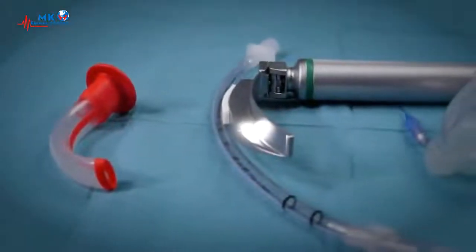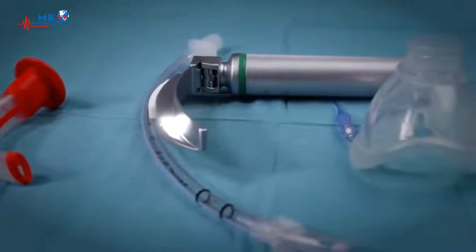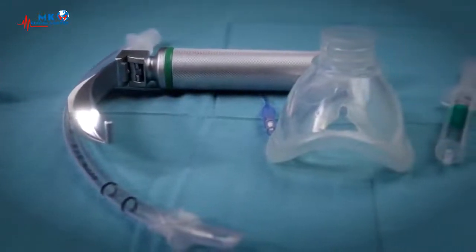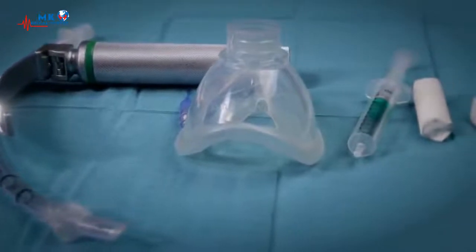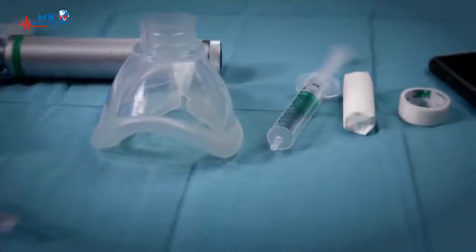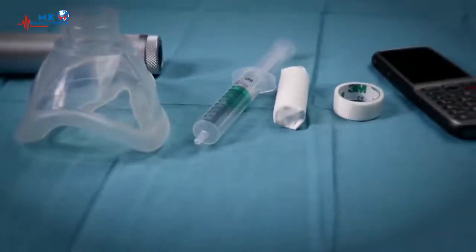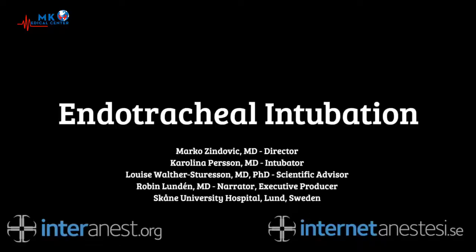Endotracheal intubation is an important part of airway management. It is best learnt through practice under expert supervision, in our opinion first on a mannequin and then on elective, uncomplicated and fasted patients. This lesson aims to prepare you for these practice sessions, and our narrow focus is teaching the manual skills that will increase your chances of success.